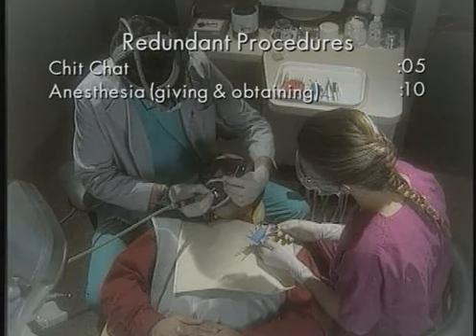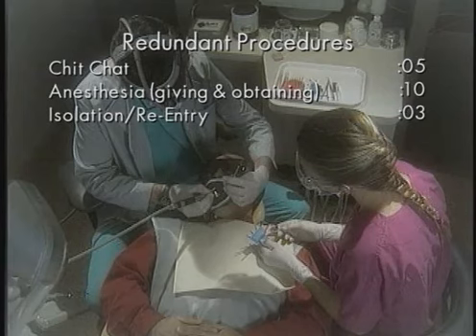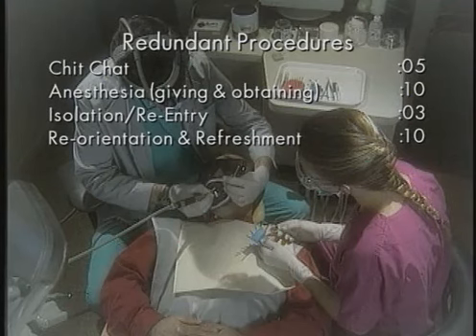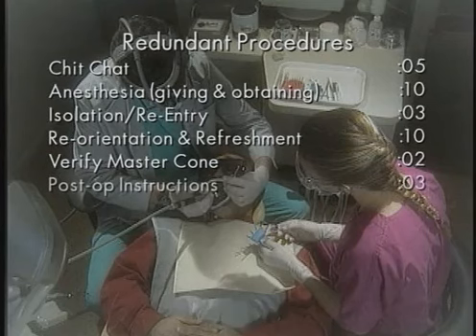Anesthesia. Giving it is not the issue, it's obtaining it. It may take several minutes to get profound anesthesia in certain kinds of cases. Isolation and reentry, although not a great amount of time, still require redundancy in procedures. Then there's reorientation. Once you get back into the pulp chamber, sometimes you'll notice exudates. Files that used to be snug apically are now loose, and it may require several instruments to get everything back like it was the last time. Now we have to verify those cones, and we have to make sure they're ready to be fit and packed. There's post-operative instructions again, and then there's more chit-chat.